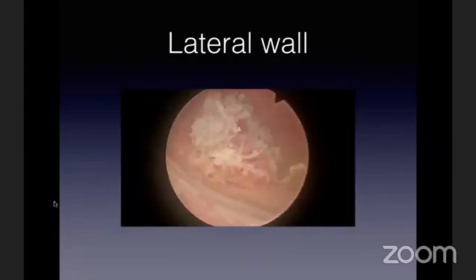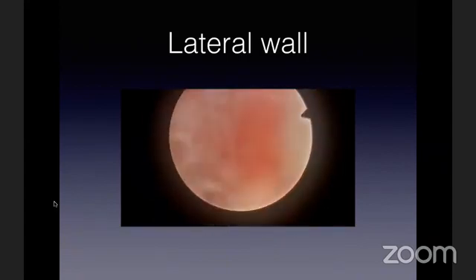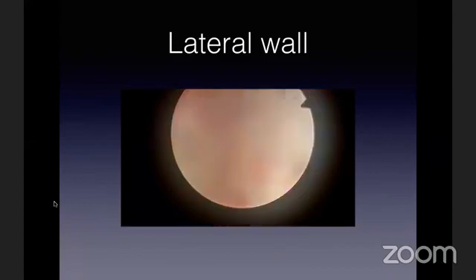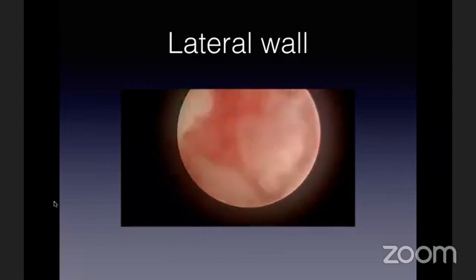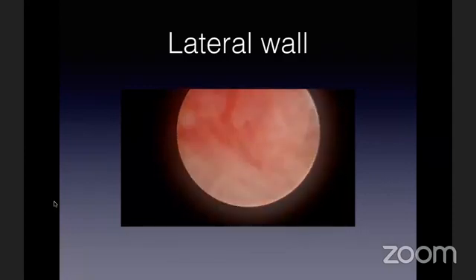For a tumor on the lateral wall, I start from 12 o'clock and try to drop the tumor towards the bladder lumen. Once I disconnect the tumor from above, it starts falling medially, allowing me to identify the stalk better. Once the stalk reduces in size, going from any direction — front to back — is easy and the tumor comes off very well.